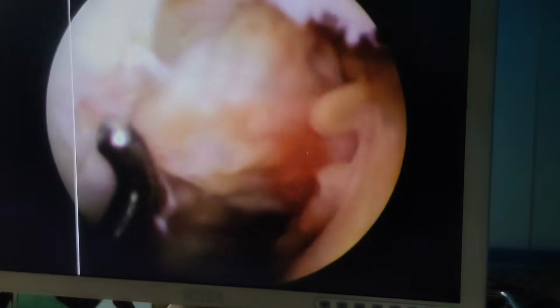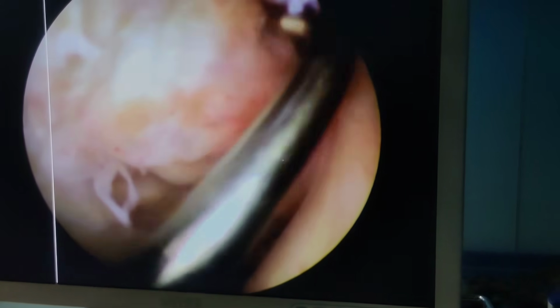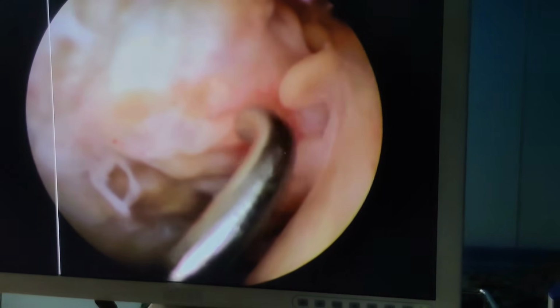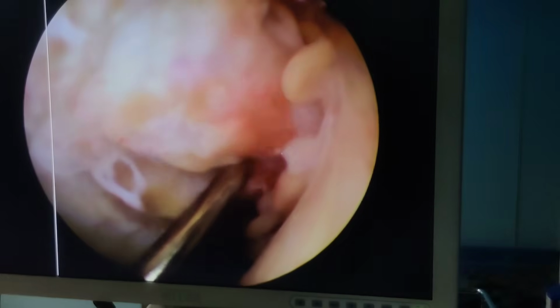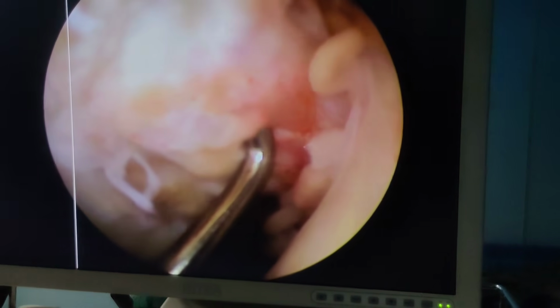Can you see the articular surface? The articular surface is just there, and this is your anterior limit of the anterolateral bundle. So this is all anterolateral bundle. Posterior medial bundle is somewhere down there. So up is anterolateral, down is posterior medial.